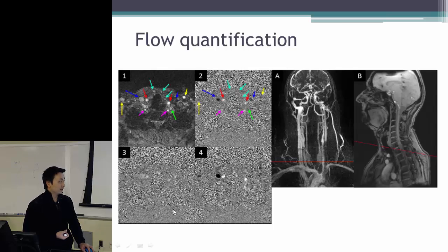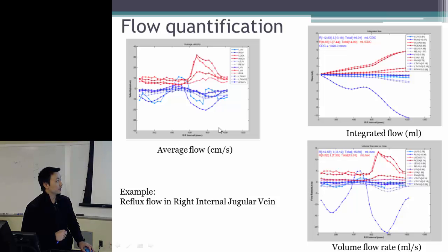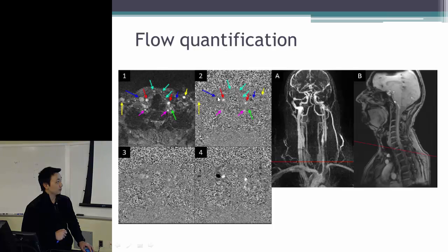And at different cardiac cycle time points, the blood flow can be fast and can be slow. With a fast blood flow, we can see a higher value of the phase. But with slower blood flow, like at the diastole, we can see a much lower phase value in here. So here is an example of this blood flow.